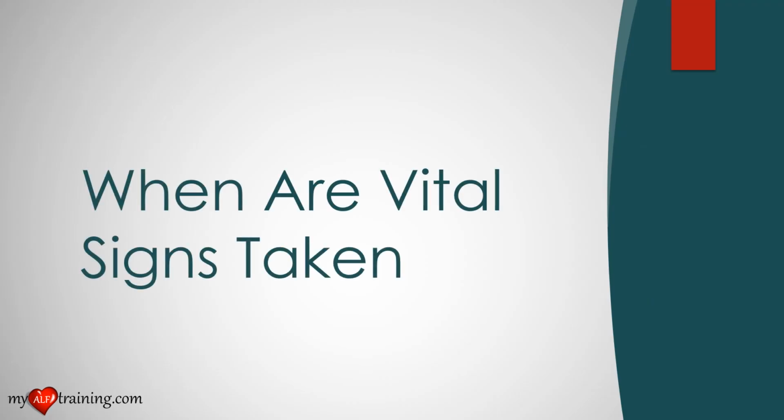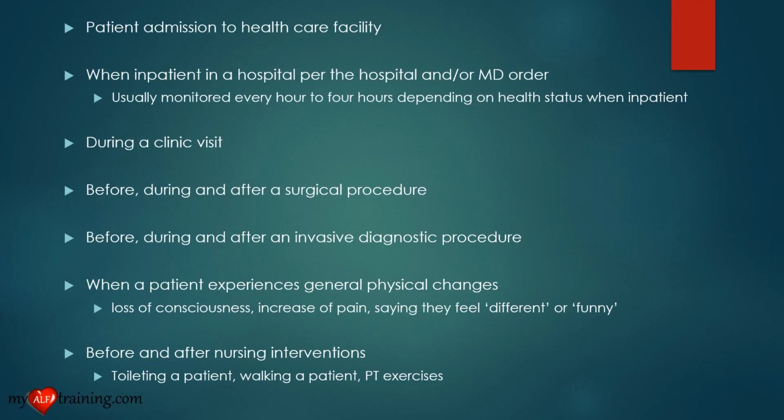When vital signs are taken, there are various scenarios in which vital signs may be assessed. The following are not completely inclusive. When a patient is admitted to a healthcare facility, when a patient is inpatient in a hospital, vital signs will be taken per the hospital policy and/or per the medical doctor's order. These are usually monitored every hour to every 4 hours depending on the health status of the patient.